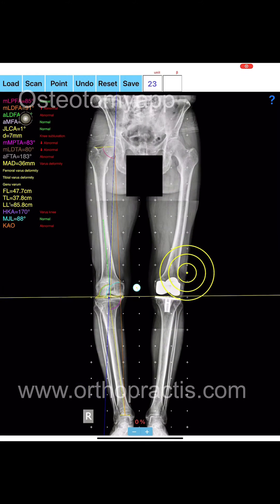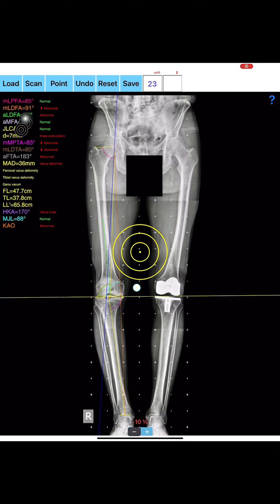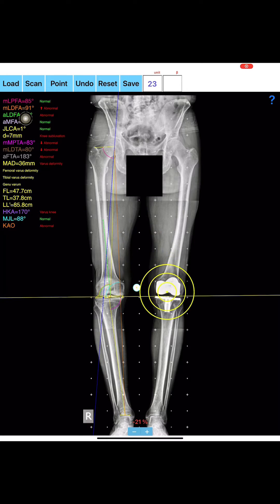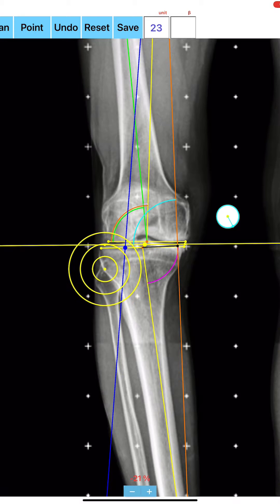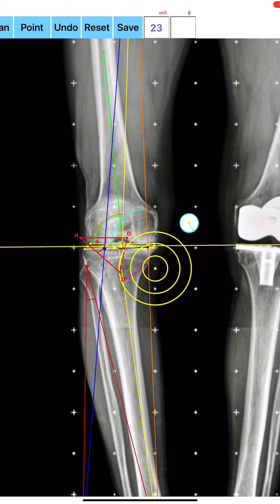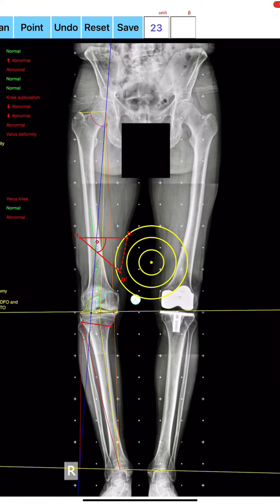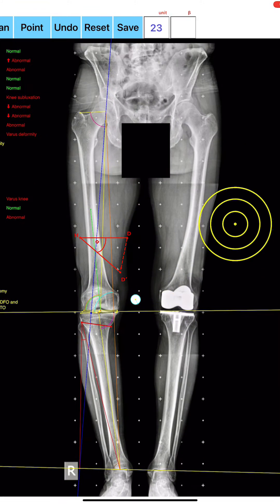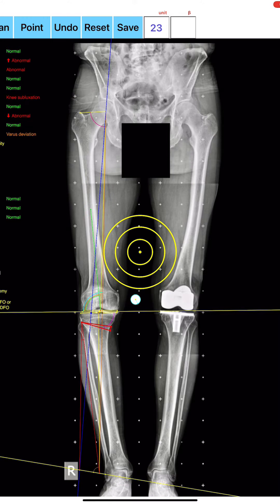The majority of osteotomies are still planned and performed using conventional techniques drawn over transparent papers with cumbersome measurements. This app assists at preoperative correction osteotomy planning by calculating the amount of correction preoperatively — including wedge size, correction angle, osteotomy gap opening or closing, and mechanical axis deviation in MM-MAD.